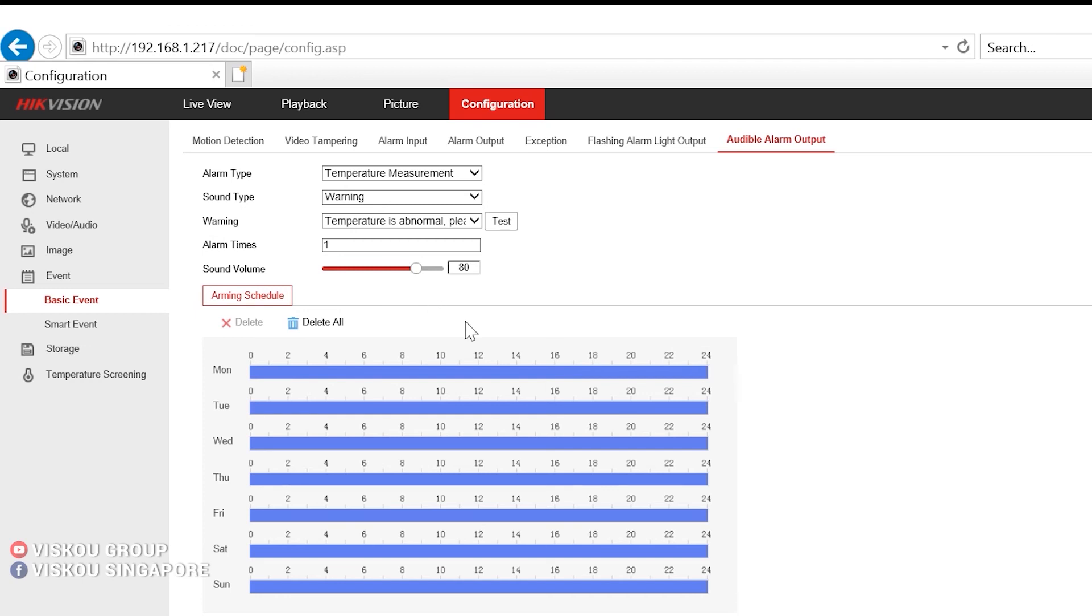And also you can set the alarm times and also the sound volume. So you must also set a schedule for this alarm output.